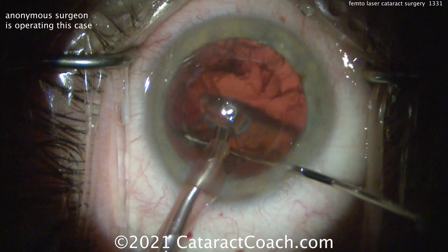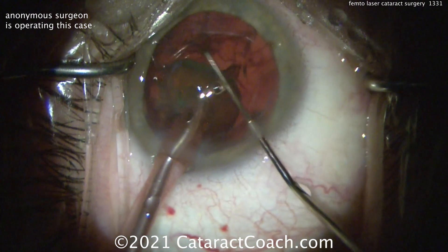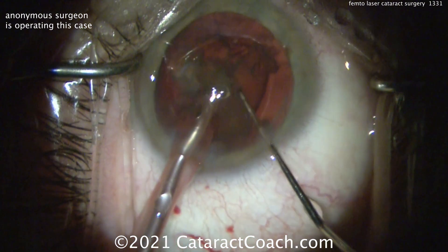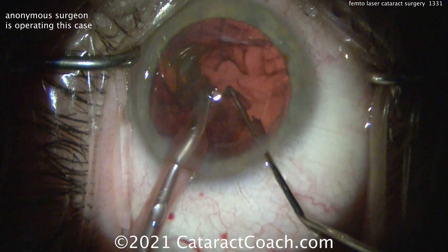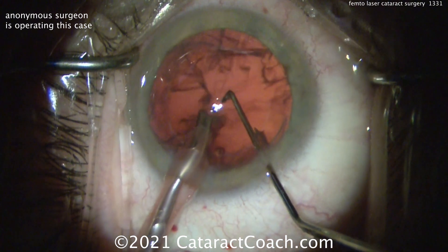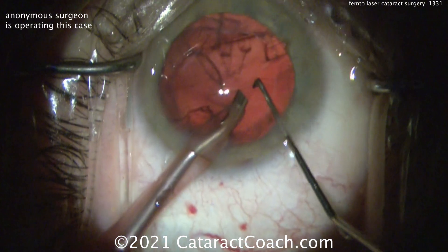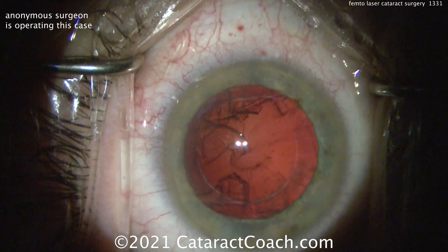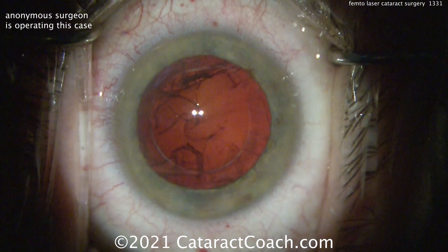Now, arguably, the incision made with the laser is actually not as good as making the incision with a steel keratome or even a diamond keratome — diamond keratome being the best, obviously. Why is that? Well, the laser delivers energy in little tiny spots. So the surface — the interface of the roof to the floor of the incision made with the laser — it's not ultra-smooth. It's kind of like cobblestone.